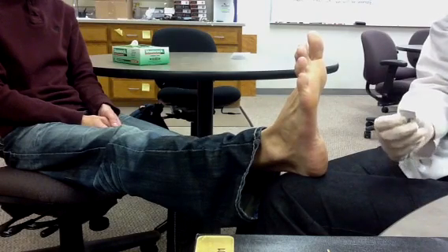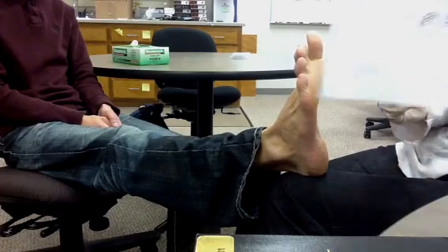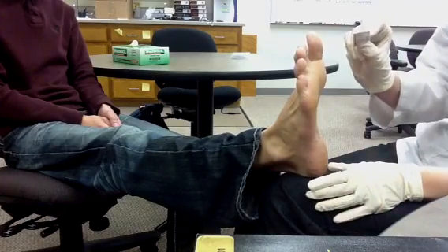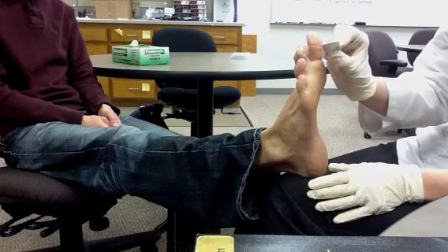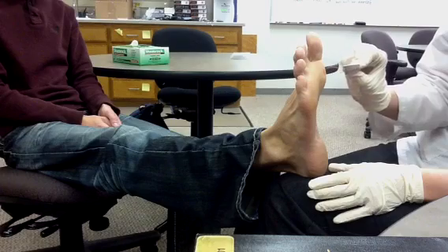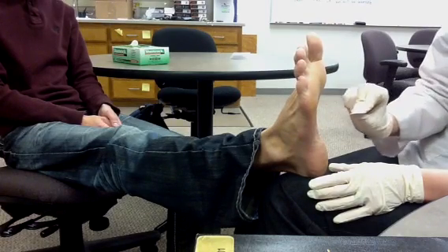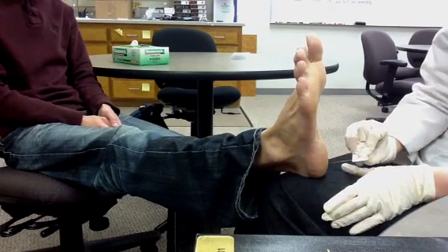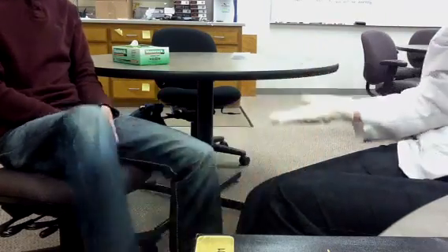You will then perform a 10-point monofilament exam. Be sure to touch each point depicted on the diagram provided on your diabetic foot screen form. Apply the monofilament to the foot perpendicularly and push until it is slightly bent. Hold for about one and a half seconds on each spot. Do not apply to ulcers or calluses. Draw a plus sign in the areas where the patient indicated feeling the touch. This will then need to be repeated on the other foot.